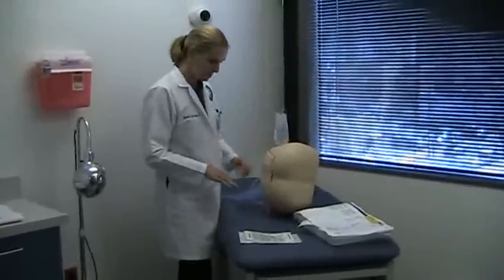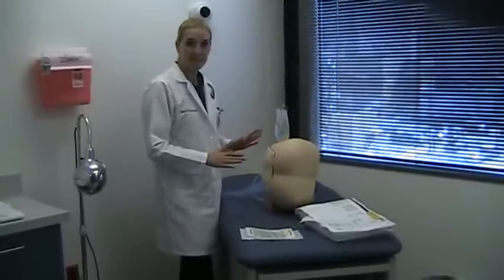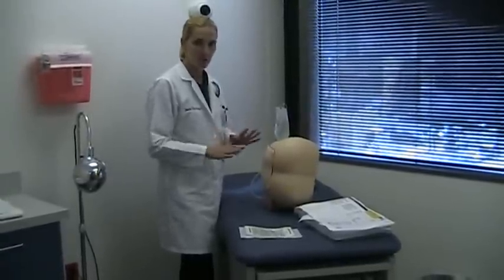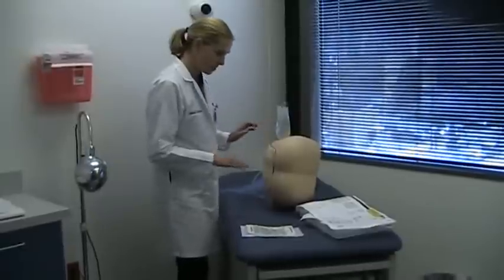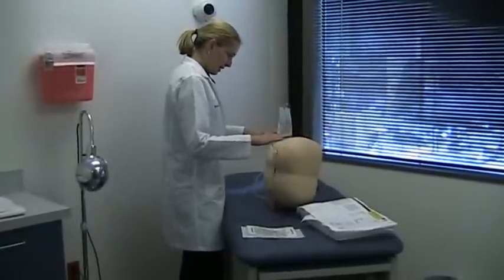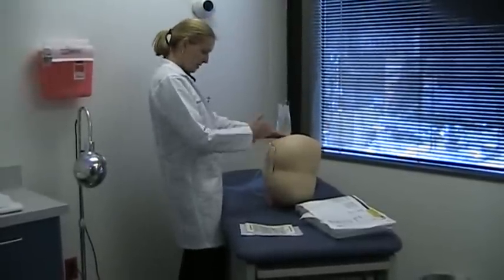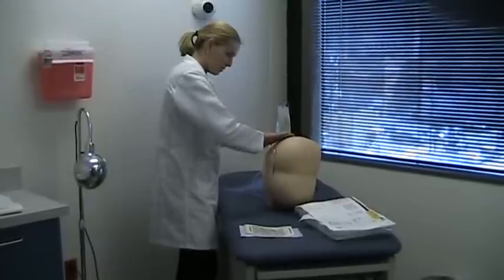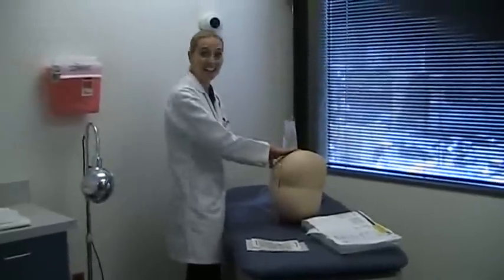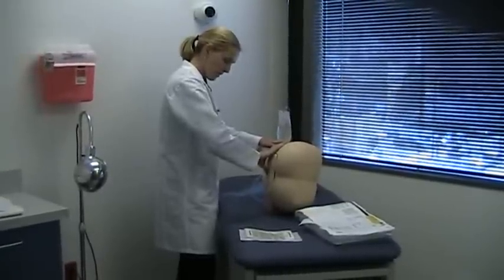Here we are in the sim center. When we are ready to start the procedure, we first make the timeout, make sure that the patient is right, labels are saved and corrected, and everything is in place. We recheck the position — lateral decubitus is the ideal recumbent position. We feel the iliac crest and draw an imaginary line to palpate the interspace.